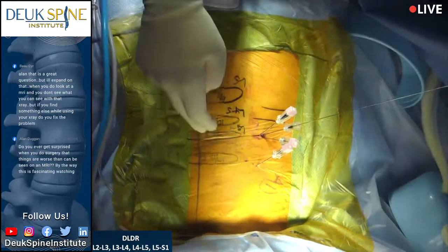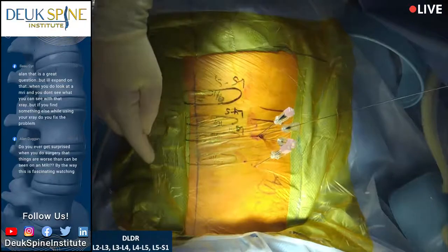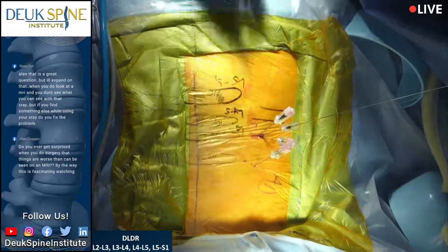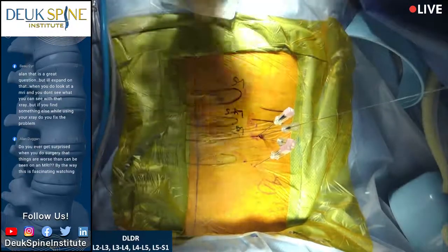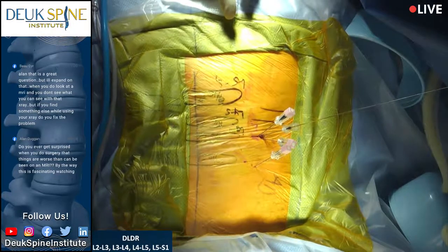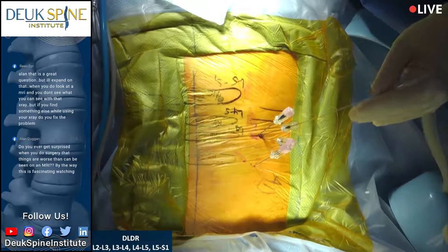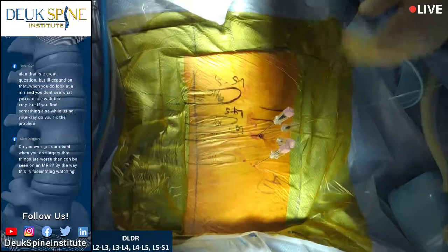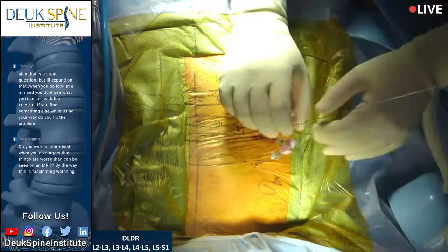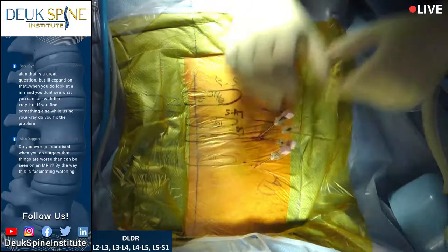So the most common cause of back pain and neck pain is a herniated disc. This patient had 4. And most importantly, on exam in the clinic, he said his pain went from here to here. This whole area was hurting him. If it was just one disc, he would point to that one disc, because the pain from these discs is highly localized due to somatic afferent innervation that goes to the somatotopic parts of the sensory cortex. All right, we'll start with L4-5. I can't talk too much, but I have to start working. Would you please show them the video on why people get back pain from a herniated disc? Meanwhile, I'm going to keep working and we're going to get this first disc fixed.